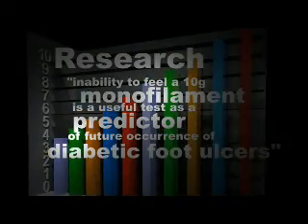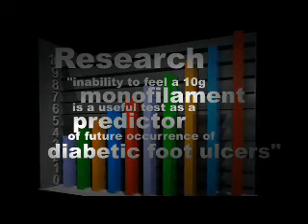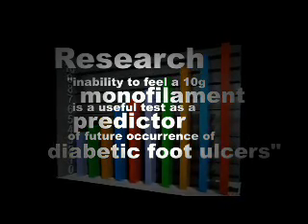Studies have shown that the inability to feel a 10-gram monofilament is a useful test as a predictor of future occurrence of diabetic foot ulcers. Inform the patient you're going to test the sensation in their feet with the monofilament. Show the patient that it's not sharp by first testing it on their forearm and then with their eyes closed as a comparison.